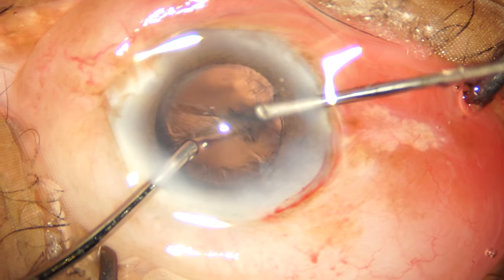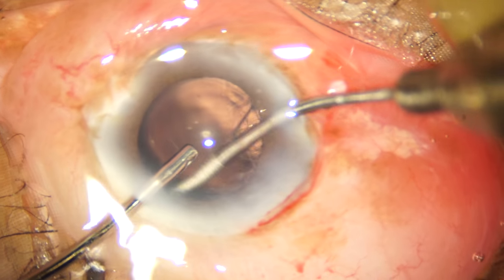My preferred technique for cortical aspiration is the bimanual irrigation aspiration.